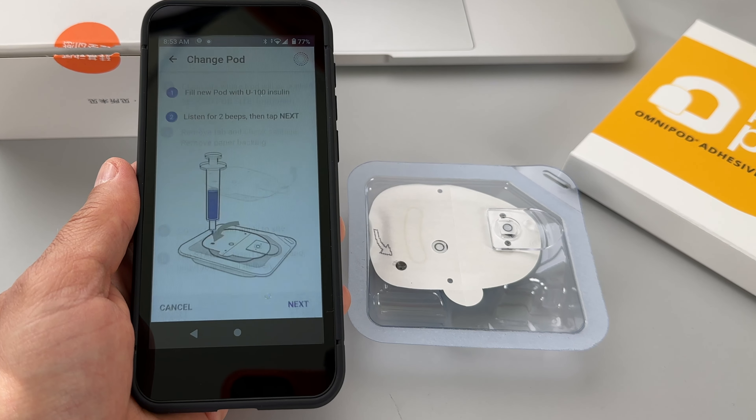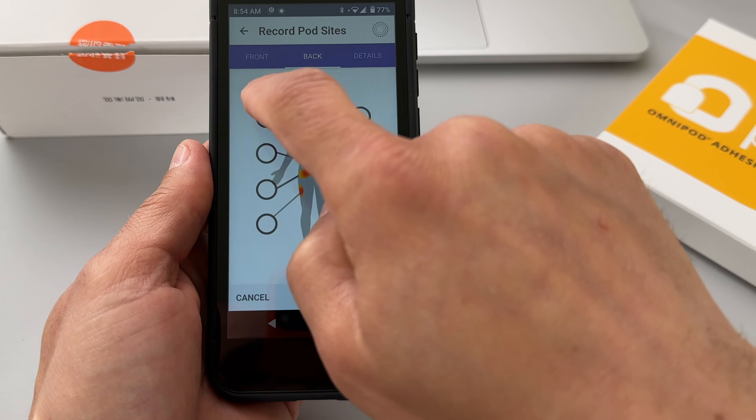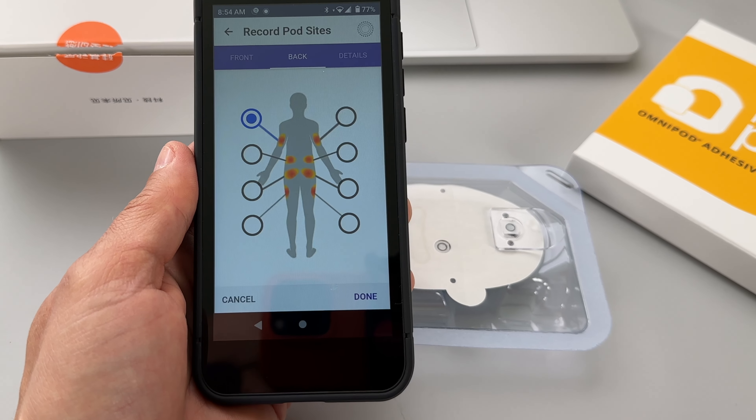The minimum amount of insulin you need to pull in is about 80 units and the maximum capacity of each pod is 200 units. I filled it all the way to 200, but later I realized I really only need about 120–140 units for three days. Just put in a little bit more than you think you will need for the three days — you don't need to fill it all the way up.